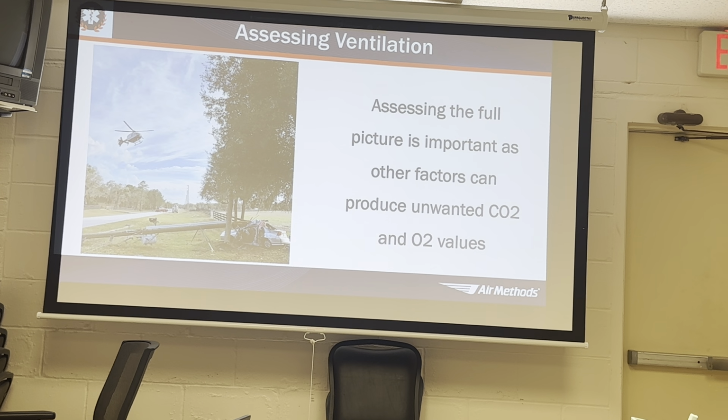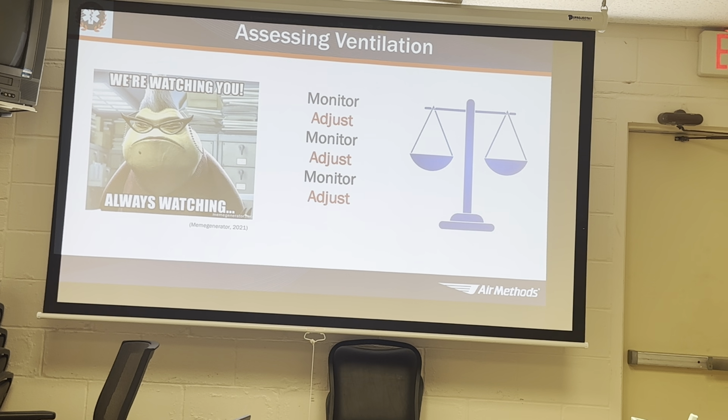This is just going back to the fact that it's going to depend on the physiology or pathophysiology they've got going on. And then of course we don't want to produce any unwanted conditions here. Ventilators do require constant monitoring and adjustment, and it really is the job of the nurse to see whether or not the ventilator is working for the patient.